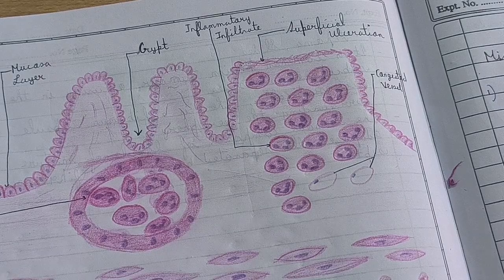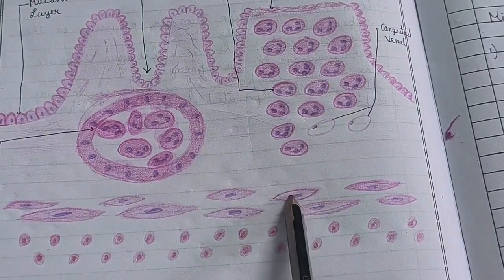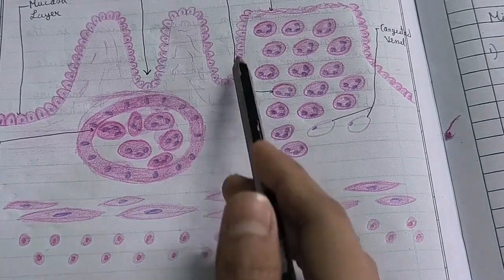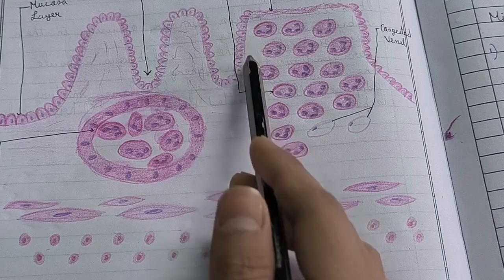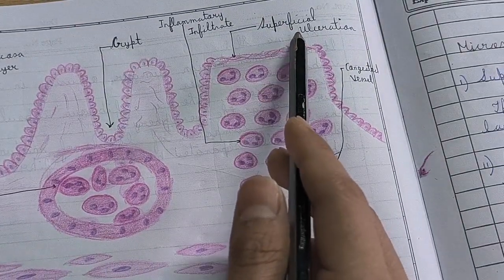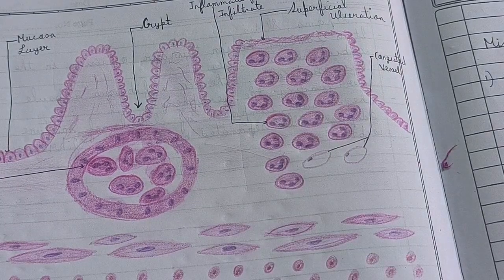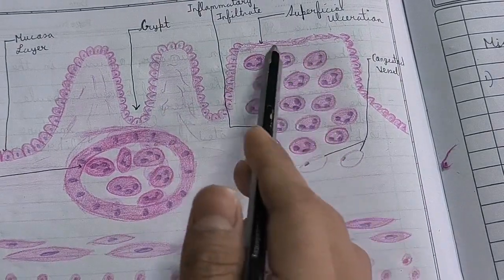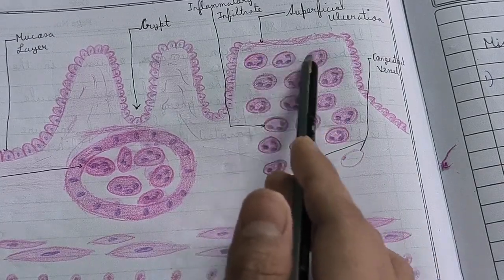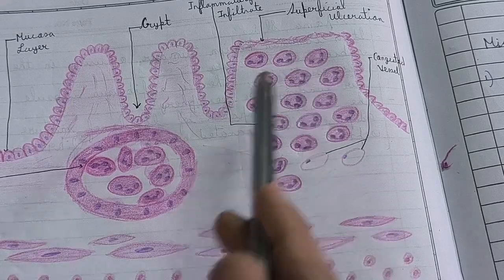Now you can see that this ulcer does not extend deeper than the mucosa layer. It stays only up to the mucosa layer, and therefore it is known as superficial ulceration. That is the first thing. Next, you can also notice that in this ulcer region neutrophils are accumulated. So these are the neutrophils, as you know.